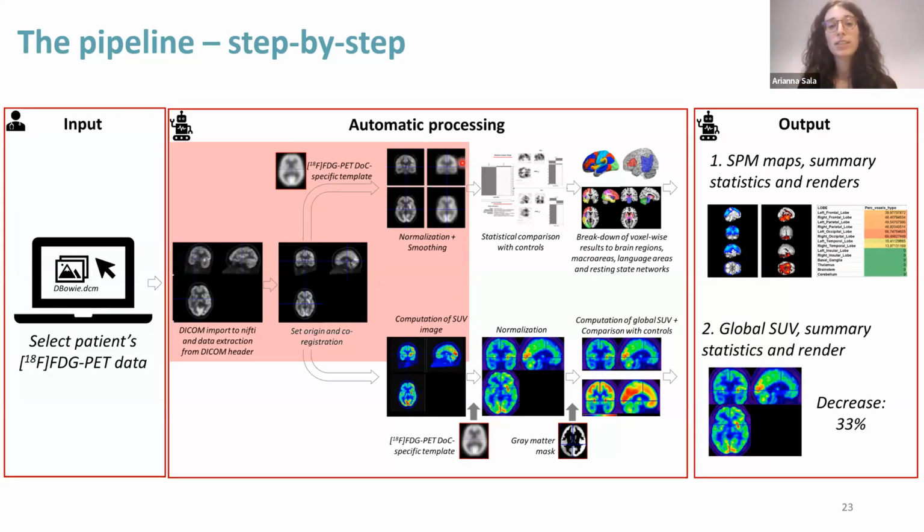Still, there is some variability that we tend to expect in patients with hugely deformed brains, as is often the case for DOC patients. So we apply a sort of smoothing. Essentially, we apply a filter, like an Instagram filter, to our image.